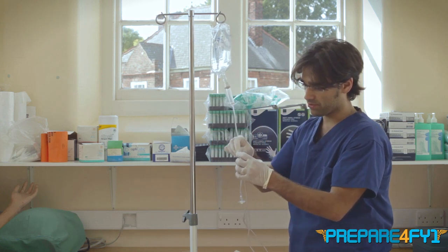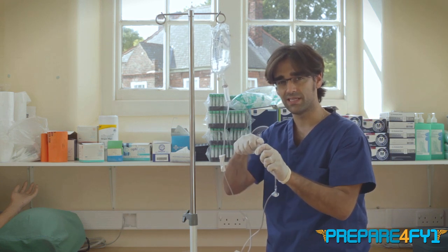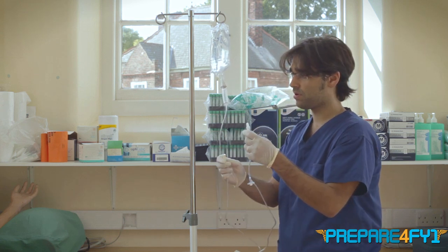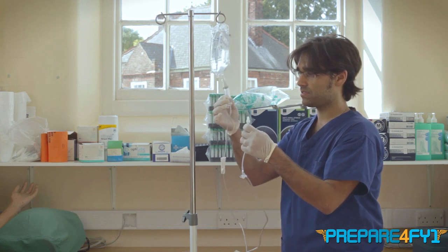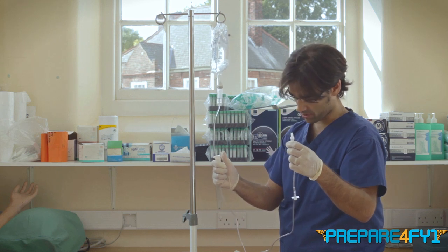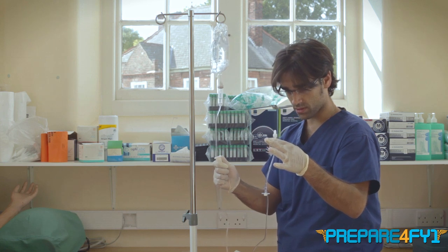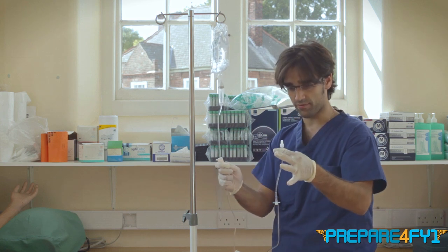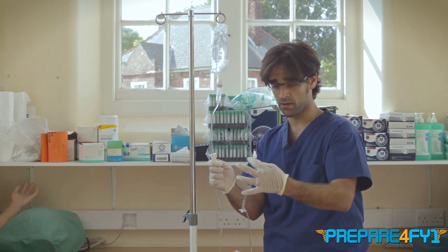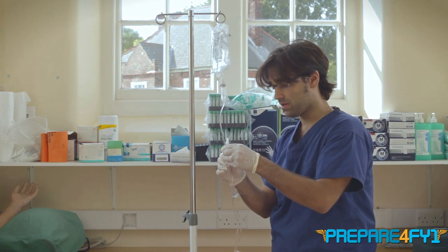Before you let fluid go through the line, it's really important to loosen the cap at the end — if fluid gets in it seals and becomes very hard to remove. So loosen that cap and leave it on. Then squeeze the drip chamber to get some fluid in it, release the wheel at the top, and you'll see fluid travelling all the way down with no bubbles. At the end, control it carefully so it doesn't spray fluid on the floor, and then you've primed the line ready to be given.